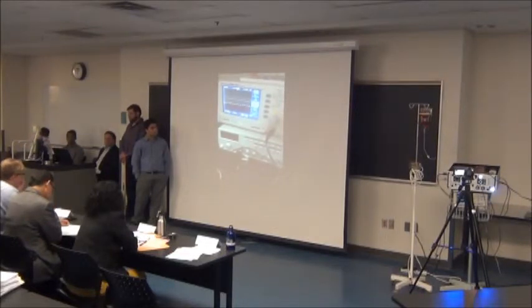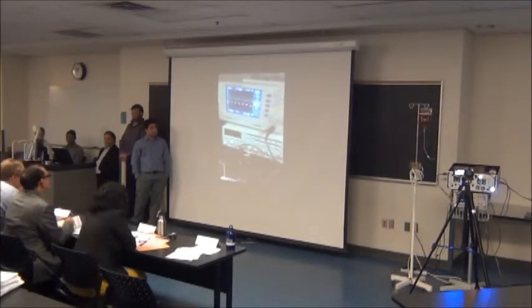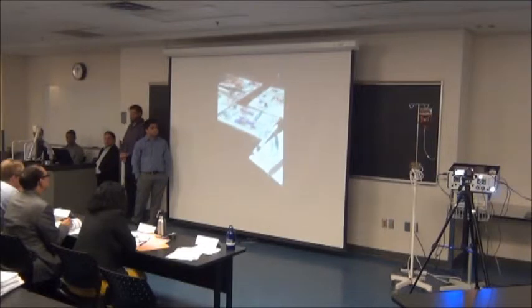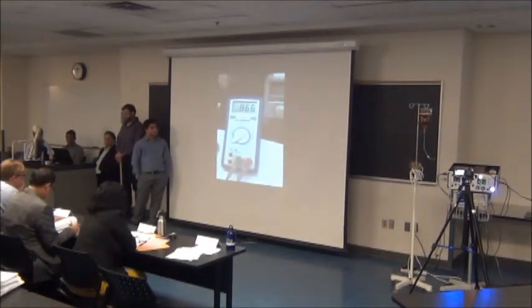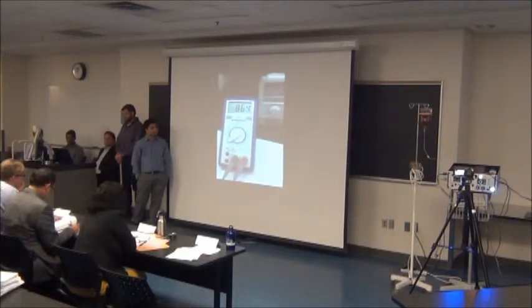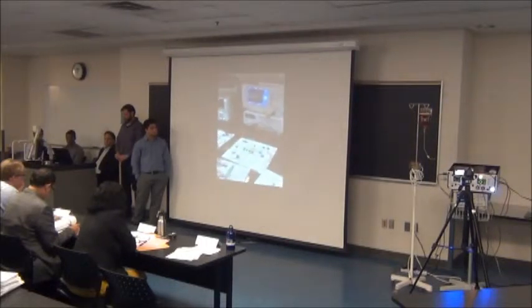There we go. And so that is going into the frequency to voltage chip. And as you can see here, what we're getting out from that is 860 millivolts.